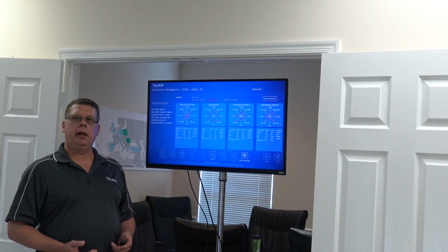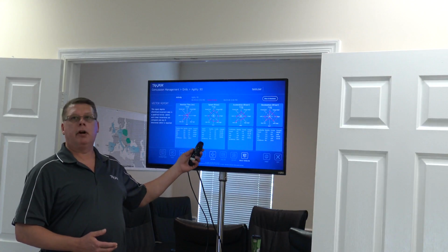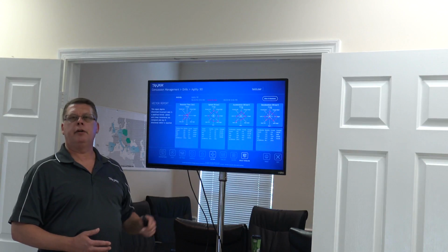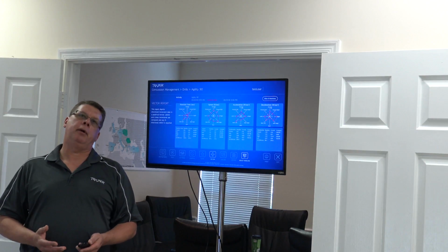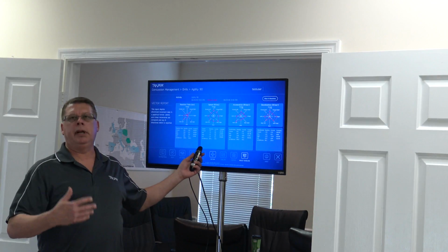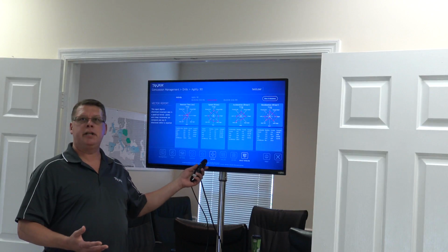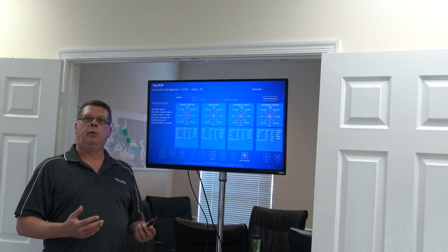A physical therapy clinic or an orthopedic surgeon or whomever can go in and see if they've recovered to a certain point or not. So even though the patient may feel that they've appropriately recovered, you can show them that they still need 1 or 2 sessions to complete that full recovery. That improves patient outcomes, it's evidence-based medicine, and it also helps with insurance companies.